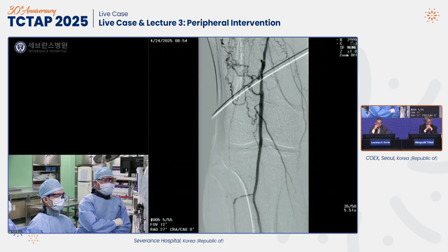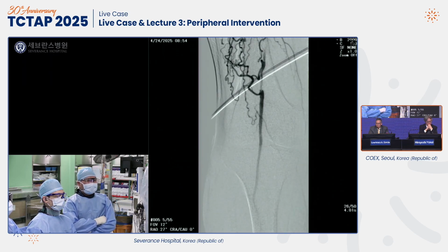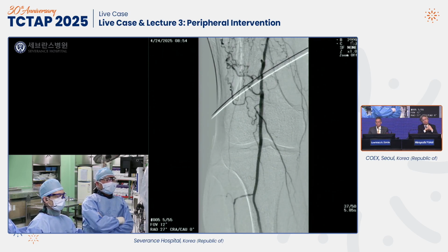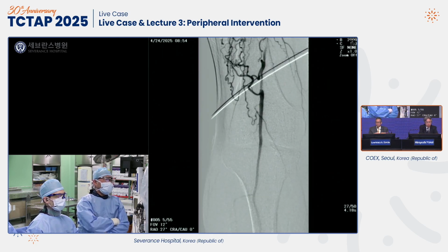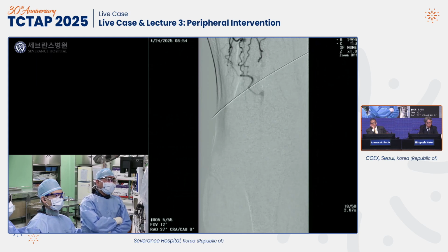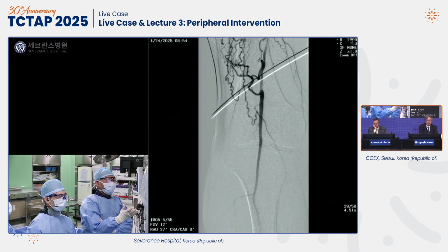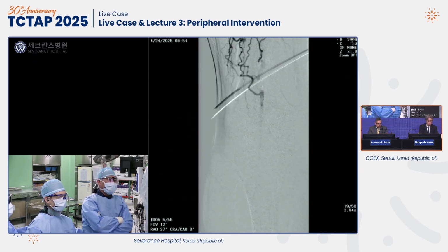The patient is under light sedation, so the patient is not under general anesthesia. For pain control, we gave some medicine, which also sedates the patient a little bit. This is good for the procedure for me and also for the patient, who senses less pain during the procedure. We also use CO2 angio, but the image is not very good, and the patient sometimes feels pain. So if the renal function is not severely decreased, I prefer to use low dose contrast angio.